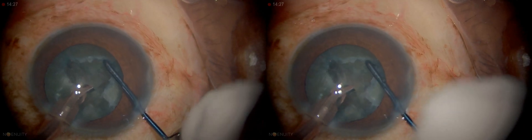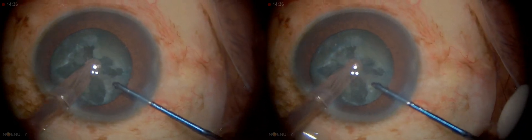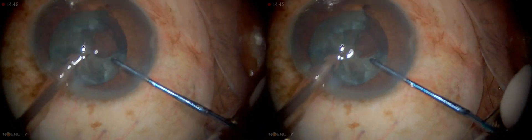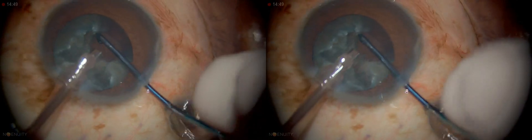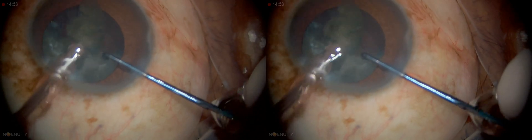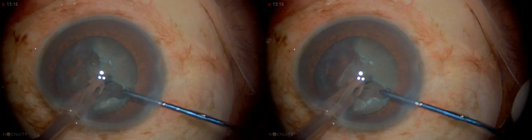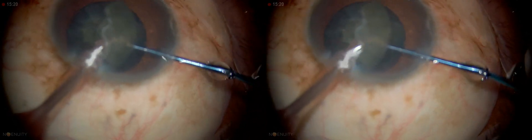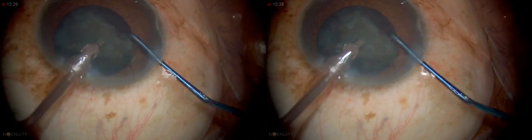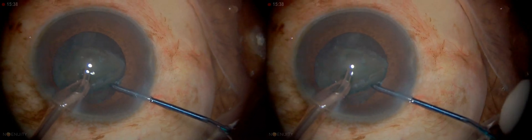We're going to move to the next quadrant removal. We're going to look for the smaller piece. As I grab it and wiggle it out — this breaks the cortical fibers. Then we rotate, just to get rid of those pieces. Move to the next piece, same thing — wiggle it out. Then we rotate again, just to get rid of those pieces. Move to the next piece, same thing. We got one piece left — that much cortex. So you usually just turn your tip to change the fluidics.